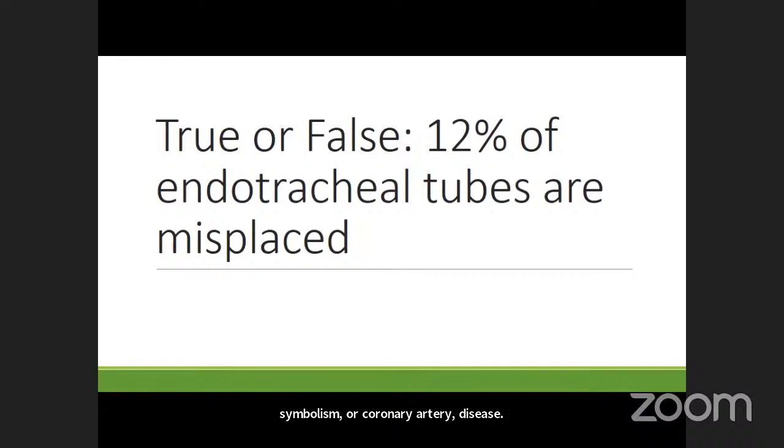True or false? And this is by EMS. We're talking by paramedics, by EMTs. 12% of endotracheal tubes, and endotracheal tubes implies endotracheal intubation, not a supraglottic airway. 12% of endotracheal tubes are misplaced by EMS during intubation.